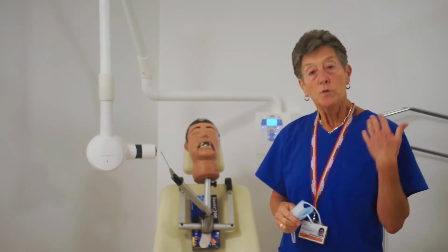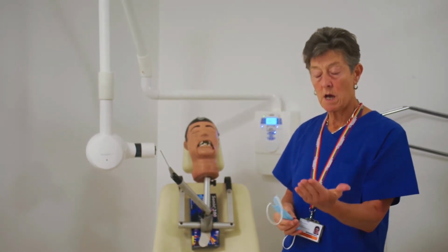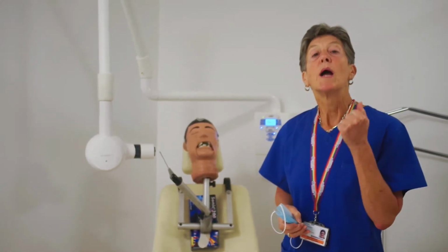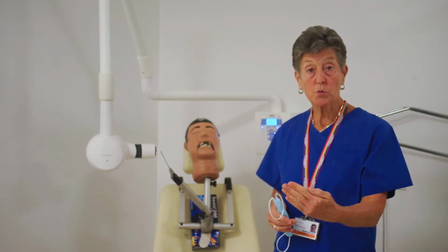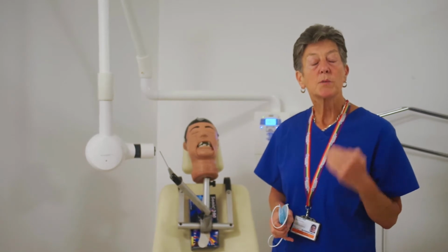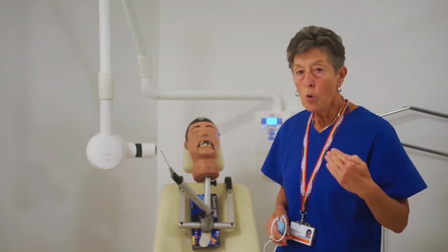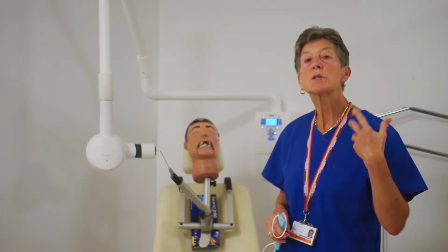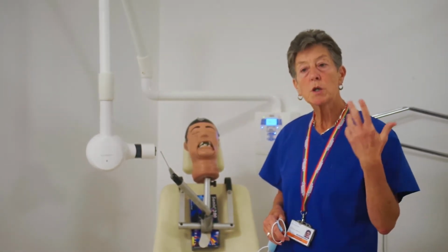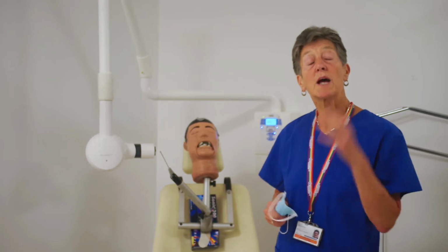We also need to remember that once you've got an image, whether it's on a film or the indirect image receptor, you have to process them. They need to be processed correctly. So they need to be processed the correct way around with image receptors, and we'll go through that in a minute. So we can avoid unnecessary repeats. And with film processing, all the processor, the chemicals, everything, which I know Carlene has gone into, they need to be the right temperature, they need to be the right concentration, so that we do not have to repeat our radiographs.